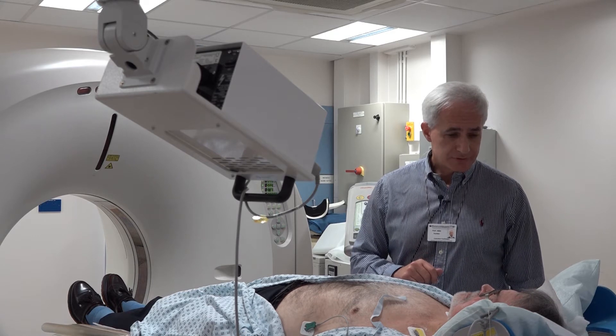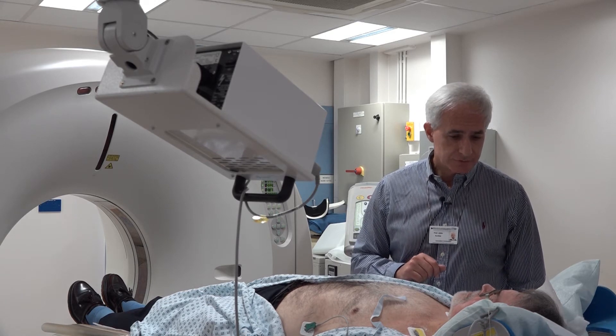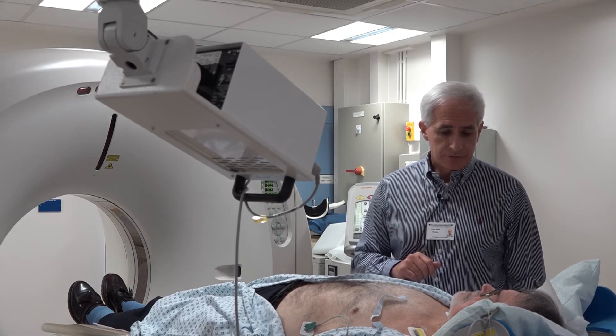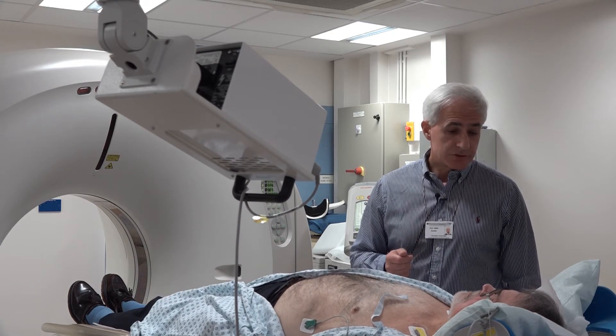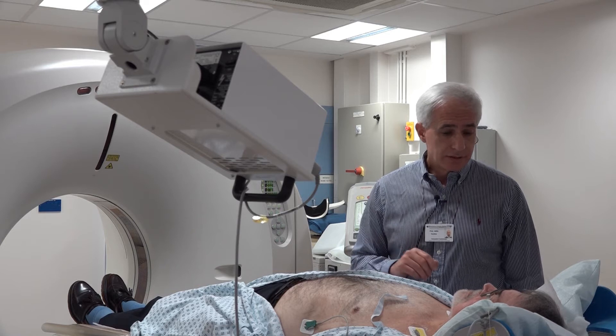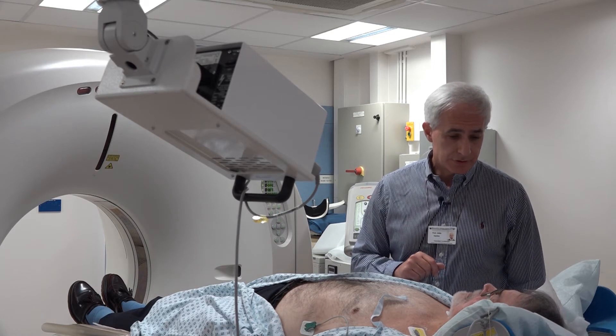The breath hold is very important because that's the time when we take the pictures of your heart arteries. If you don't hold your breath or can't hold your breath, we can still take the pictures, but they will be blurry and some will not be interpretable.